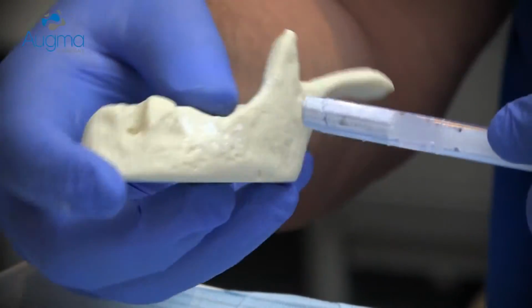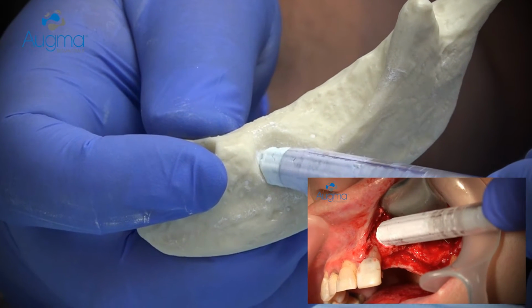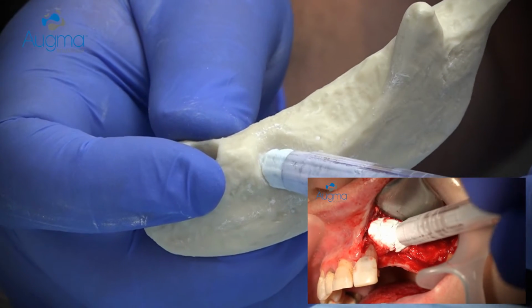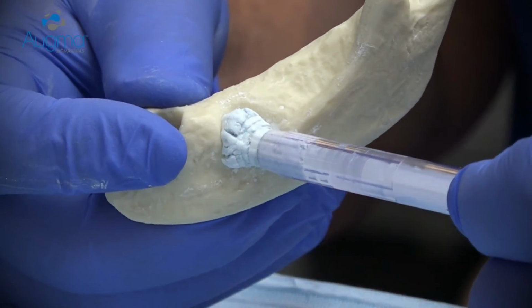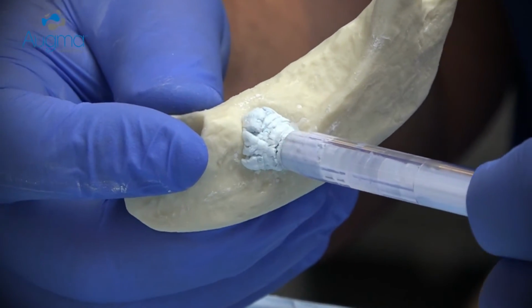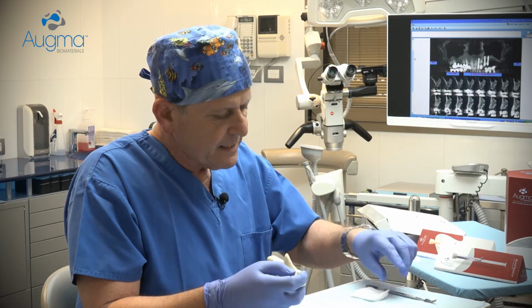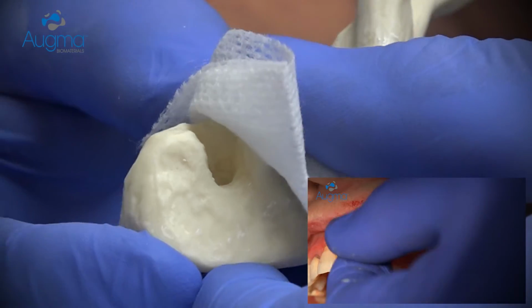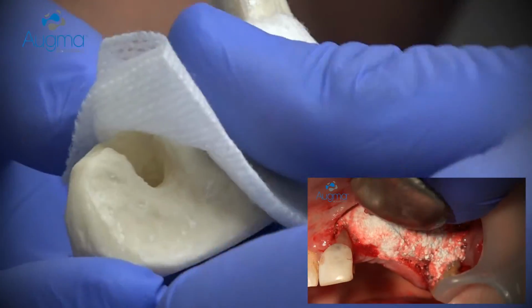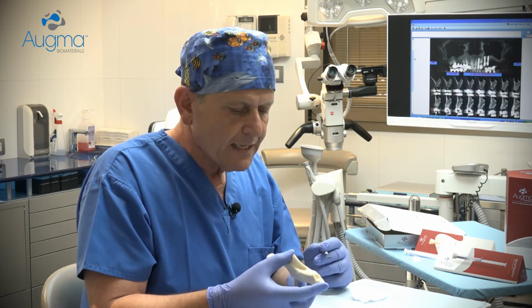Approach to the defect site in 45 degrees angle and start ejecting the material into the grafted site. Now, during the ejection, use the syringe head in order to help you to stabilize the material by a small condensing movement. At this stage, you should take a dry gauze, place it above the cement and press it firmly for 3 seconds. Now the material is already well stabilized.